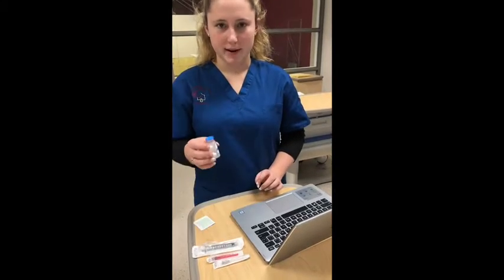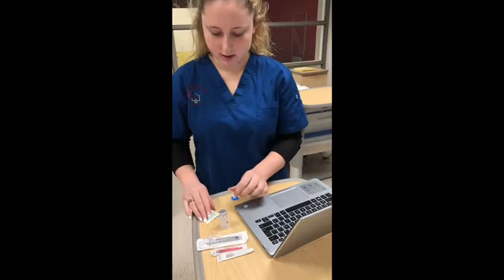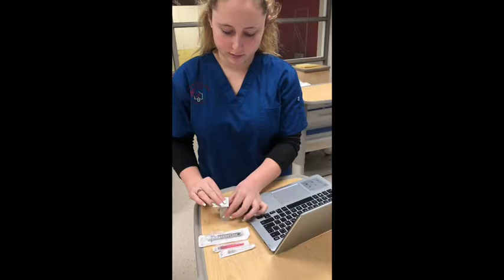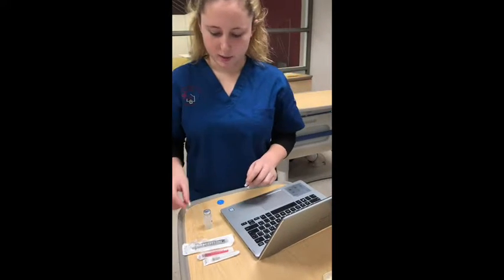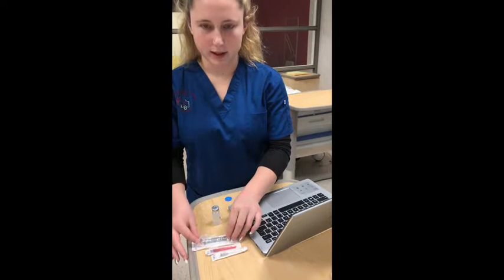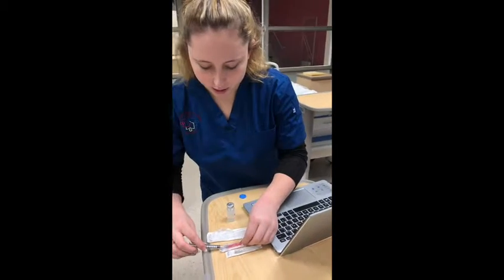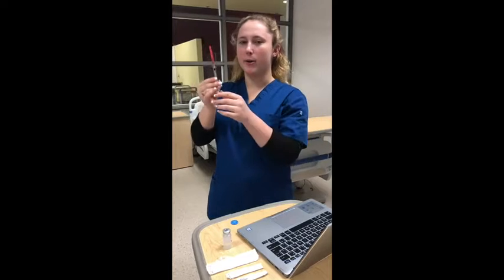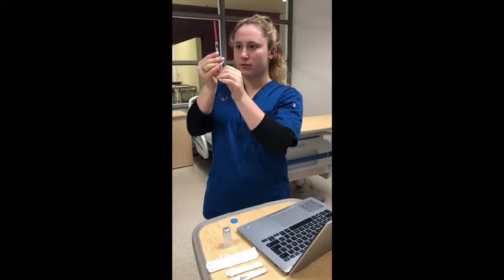So I'm going to start with getting my vial, and I'm going to take the cap off of it, and then I'm going to clean it with my alcohol swab, and then dispose of that in the garbage. And then I'm going to grab my 1 milliliter syringe and attach it to the blunt fill needle. So now that I have my blunt fill needle on, I'm going to pull back 0.25 milliliters of air into the syringe.